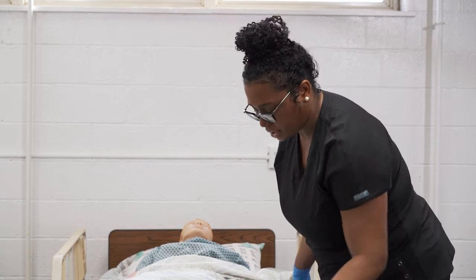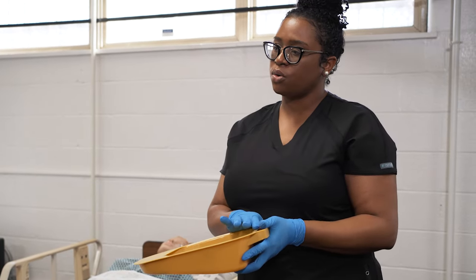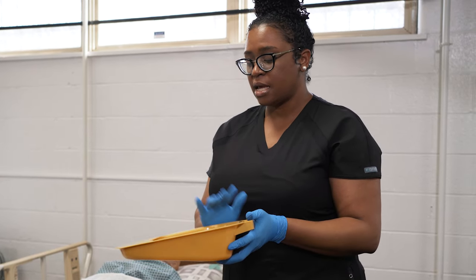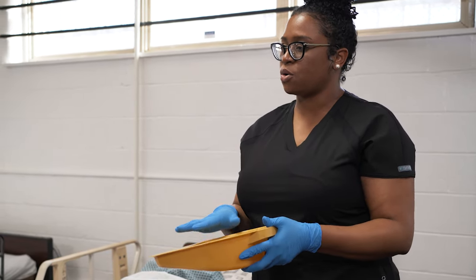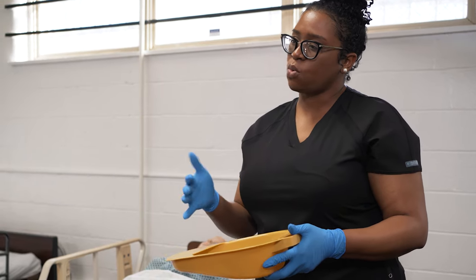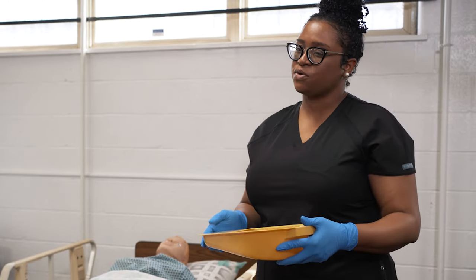Take your bed pan, cover it, go to the restroom, and check for COCA — color, odor, characteristics, and amount. Make sure to report any unusual findings to the nurse. Then empty, clean, sanitize, and store the bed pan or fracture pan according to facility policy and procedure. Remove your gloves and wash your hands, assist the resident to wash her hands, and then do final steps.